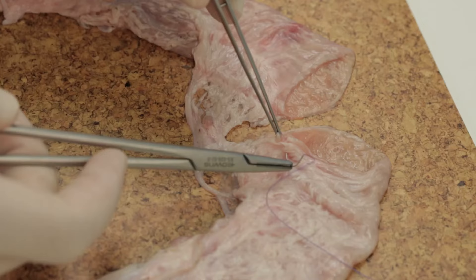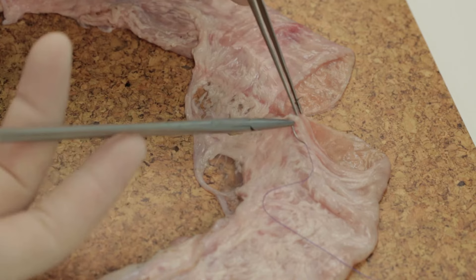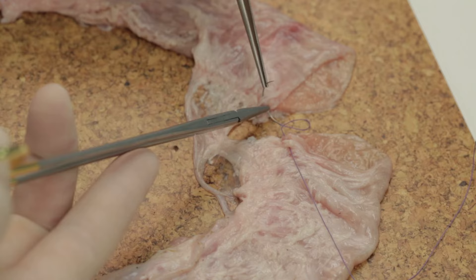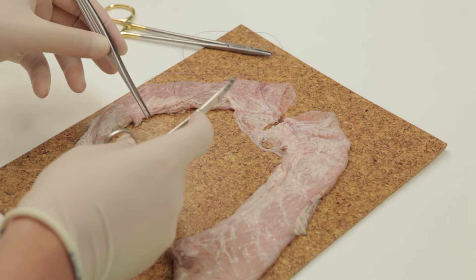To commence, a seromuscular stay suture is placed at the mesenteric border. Once this has been pulled through, the suture should be clipped and then cut.